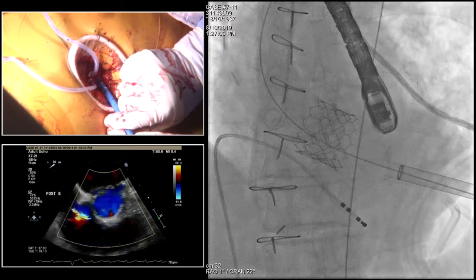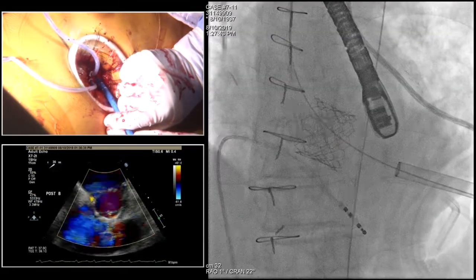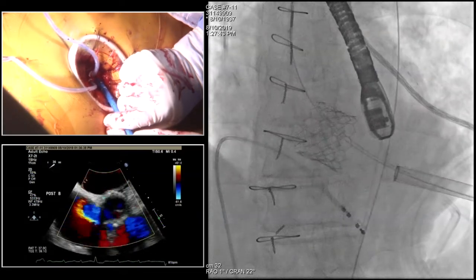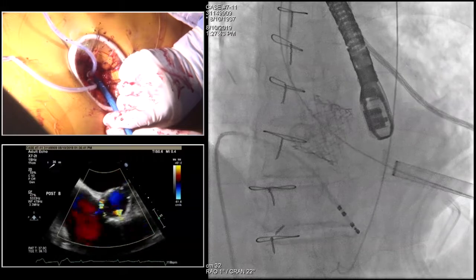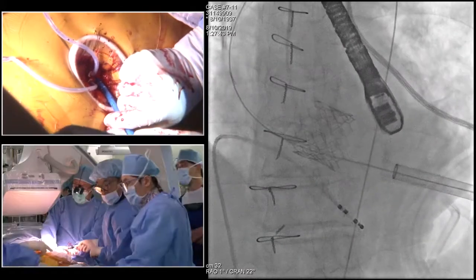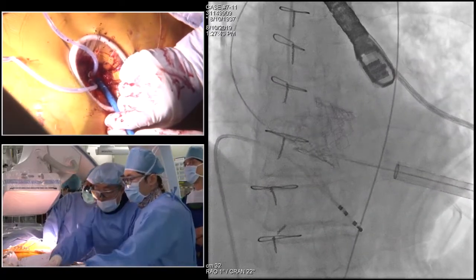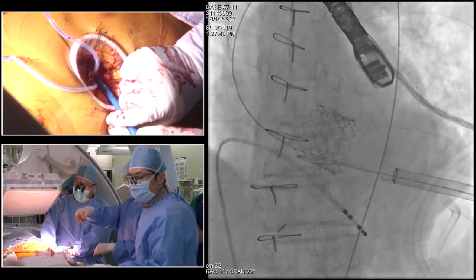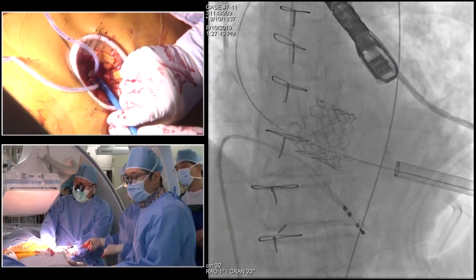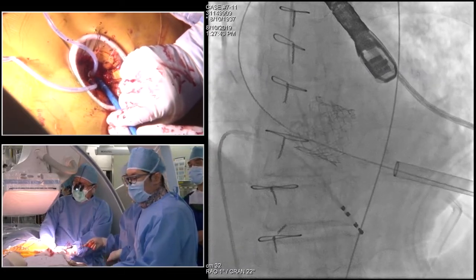Okay, 됐어. 이거 와이어 그냥 빼도 되죠? 다 빼고 한번 찍어보자. 어차피 와이어 빼도 되니까. 자, 천천히 와이어 빼고 깨끗하게 한번. 테르모로. 아, 그래? 네. 테르모로 바꾸고 뺄까? 네, 오케이. 자, 그러면. Okay, we're gonna. That is safe. Yeah, that is safe. To prevent the embolization of the atherosclerosis from the aortic arch. Okay. 자.